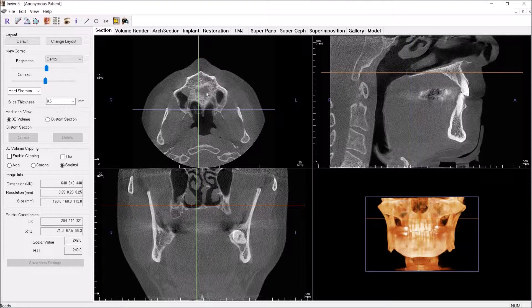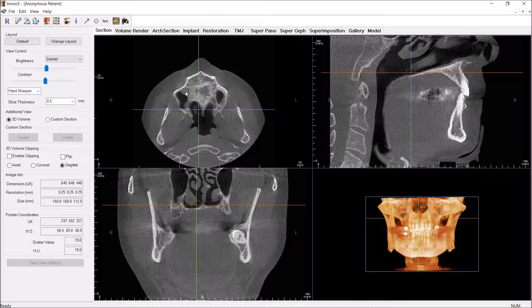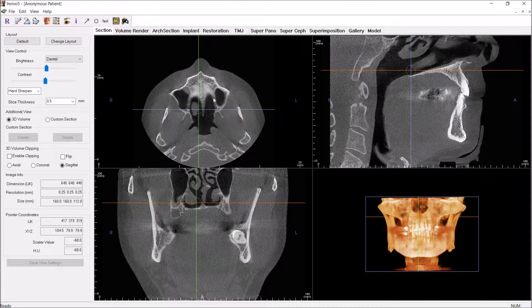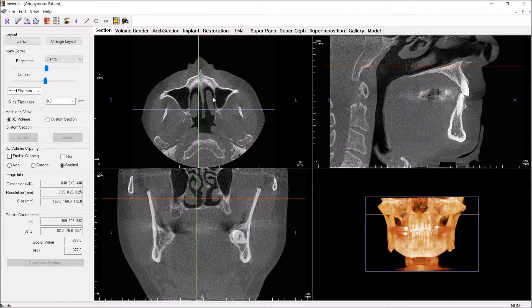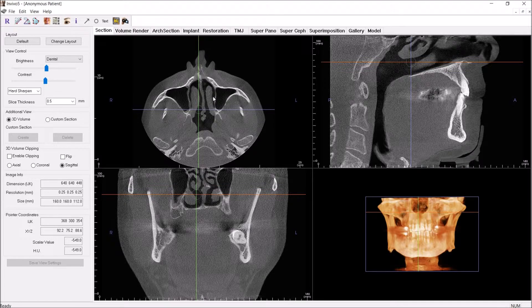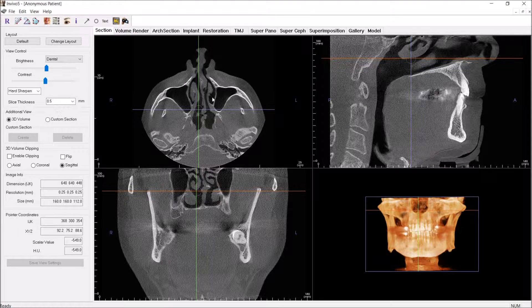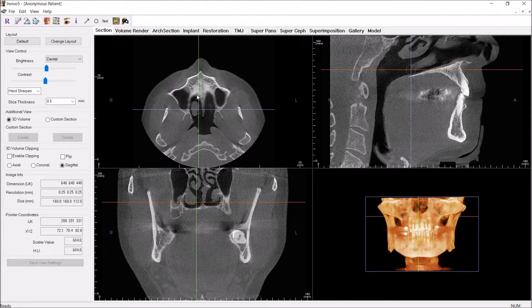Here I'm starting to get into the maxillary sinuses. I see signs of mucosal thickening of the maxillary sinuses, which is really common — you'll probably see that on most patients. I might classify this as a moderate thickening.